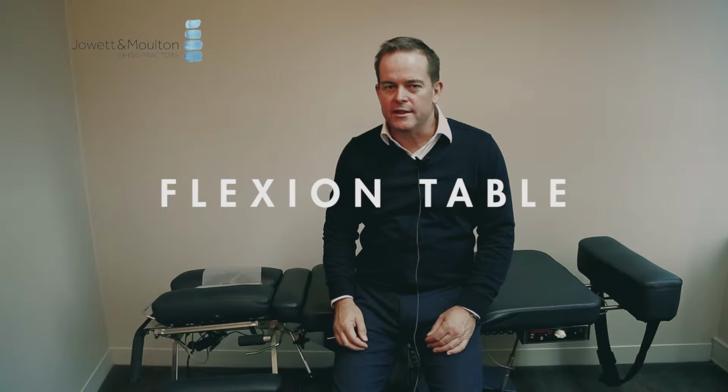We're going to demonstrate today this Flexion distraction table that we have in the practice. This is a very handy tool that we have. We use it primarily for disc problems and other degenerative conditions of the lower back.